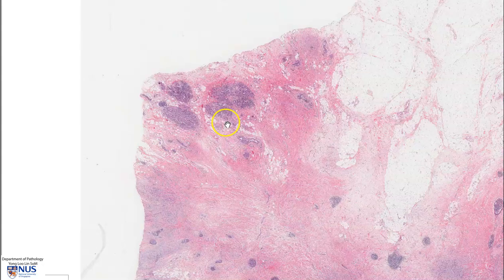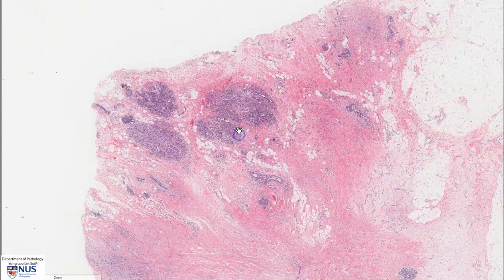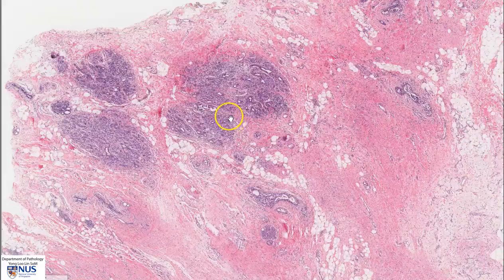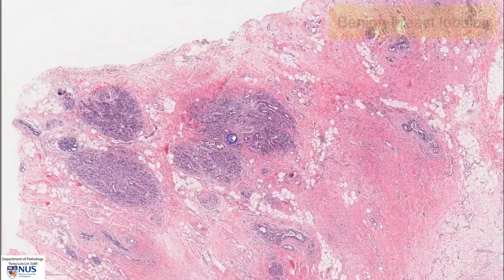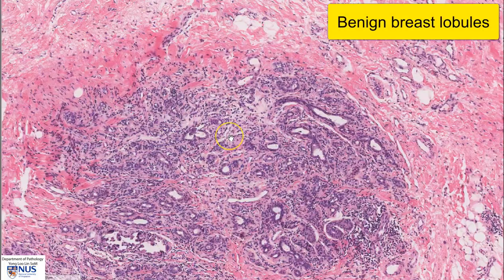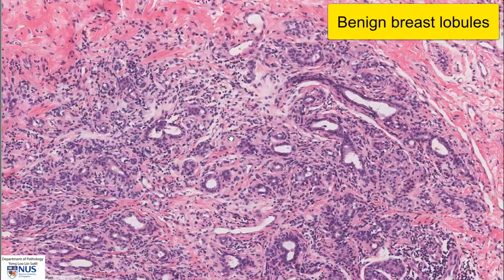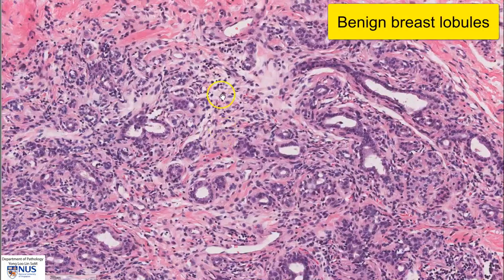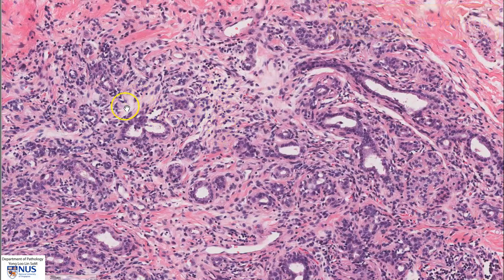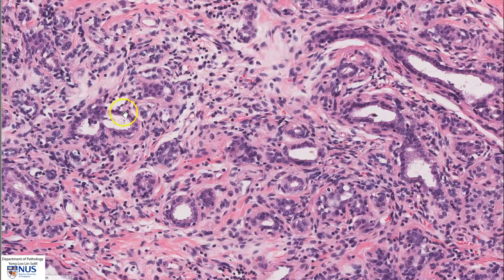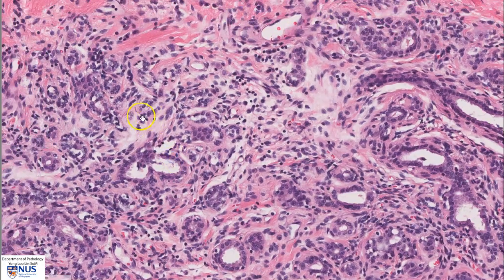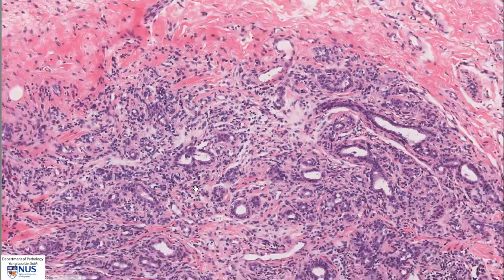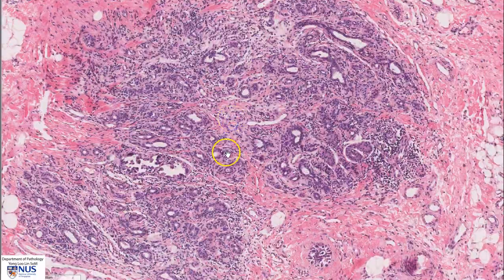We can see that there are some benign breast lobules here, and there is some inflammation and lymphoid infiltrates within the lobules, within the intralobular stroma, but there is no evidence of tumor here.